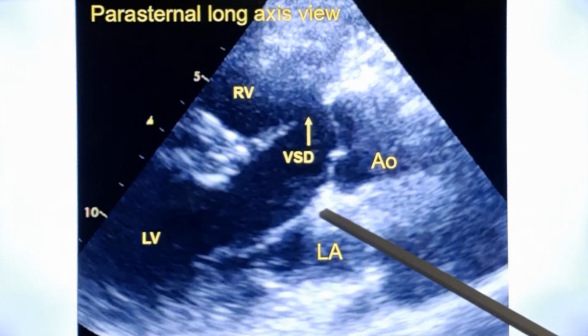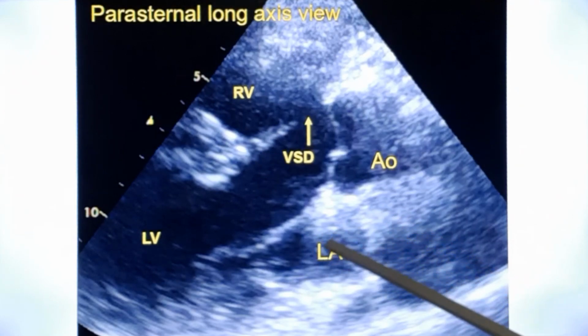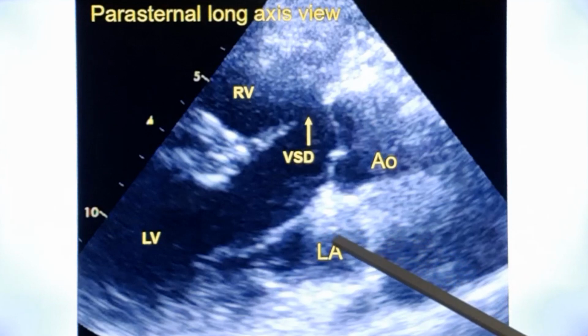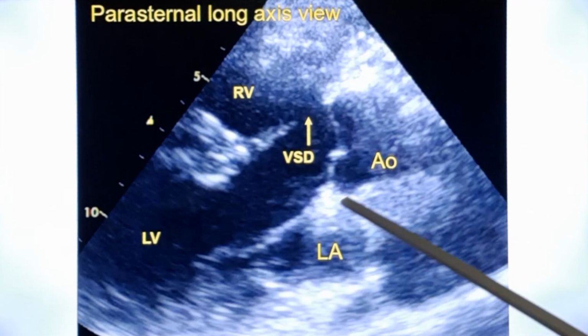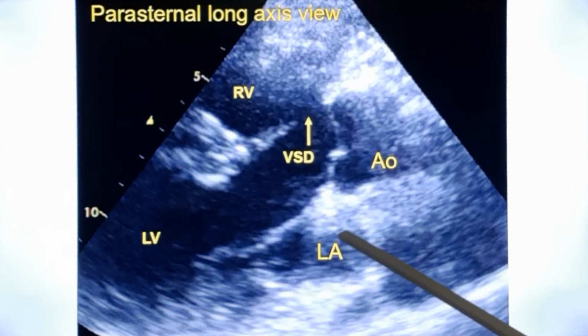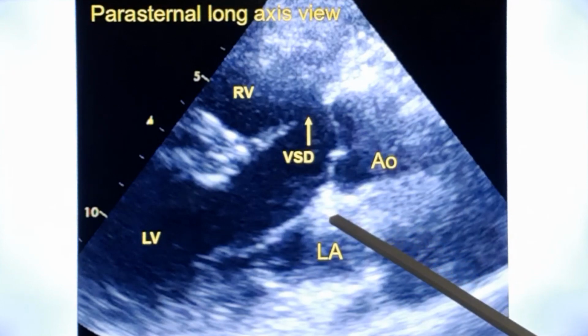The shadows are here. You could also see some shadows in the left atrium. So this need not be a true conus. It could be just an artifact also because you are seeing shadows within the left atrium also. And if this is indeed a conus, that will be a point in favor of double outlet right ventricle rather than tetralogy of Fallot, because conus is usually seen below the pulmonary valve, and if bilateral conus are seen, it is a feature of double outlet right ventricle.